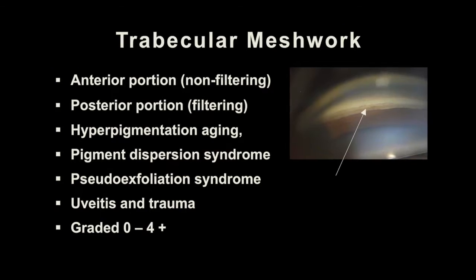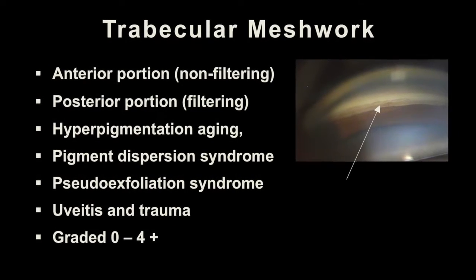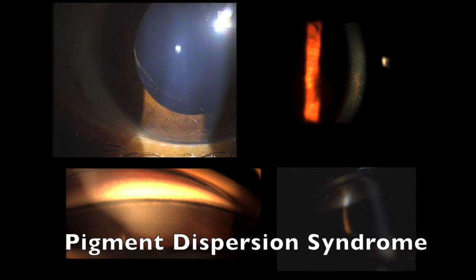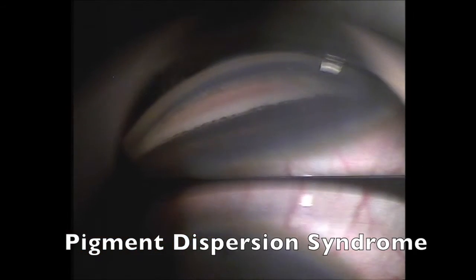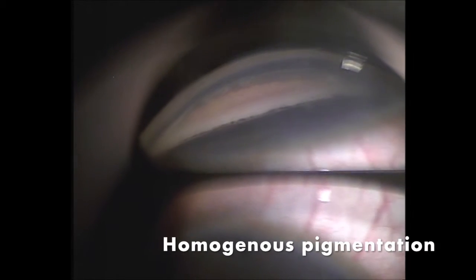The trabecular meshwork has an anterior non-filtering portion and a posterior filtering portion, which is pigmented. Pigmentation can be segmental and is more in the inferior angle due to gravity. Hyperpigmentation is found in aging, pigment dispersion syndrome, pseudoexfoliation syndrome, uveitis, and trauma. In pigment dispersion syndrome, trabecular pigmentation is heavy, homogeneous, and uniform.